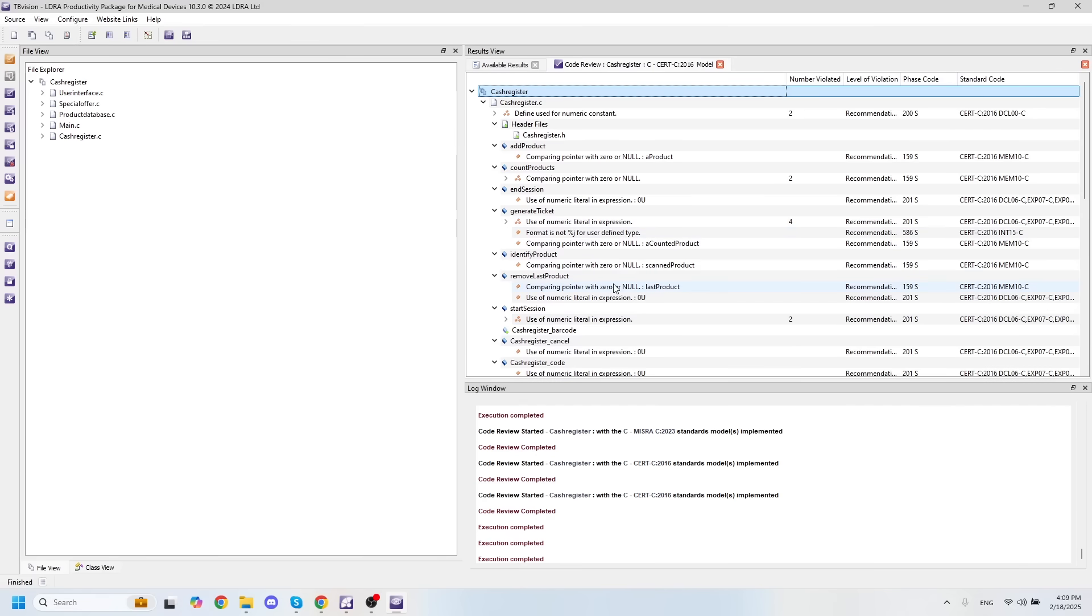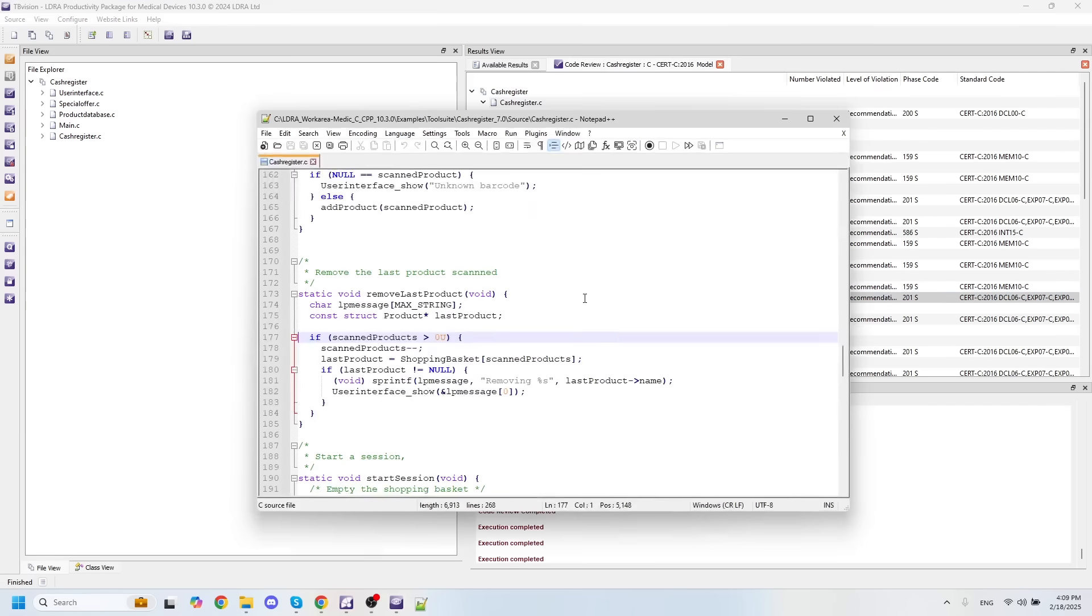If I'd like to take a look at any point in my code where some of these violations occur, all I have to do is simply double click on one of the violations, and these will get pulled up in Notepad++ or whatever text editor you choose.